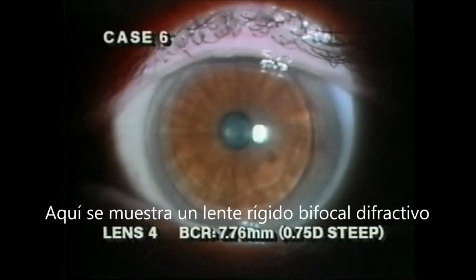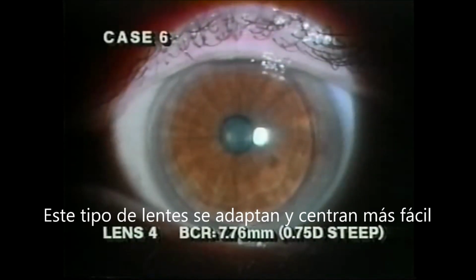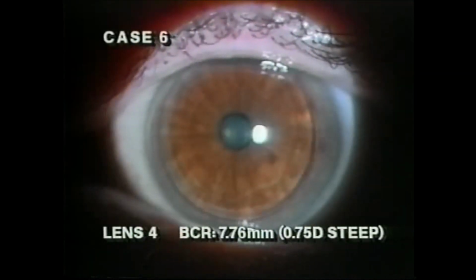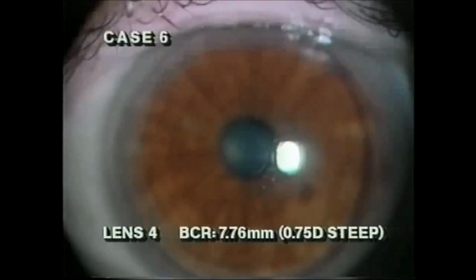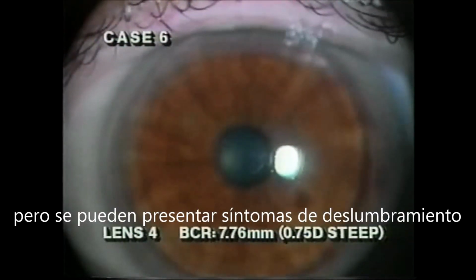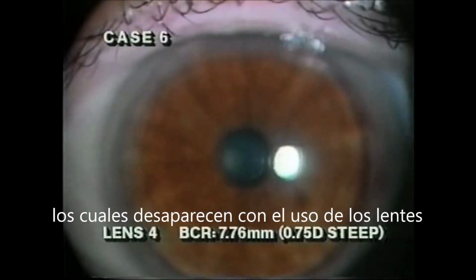A rigid diffraction bifocal is observed here. This lens offers advantages of pupil independence and ease of fit, as both prism and truncation are unnecessary with this design. To minimize symptoms of glare, it must center well. Patients generally need a higher amount of illumination when performing near work.